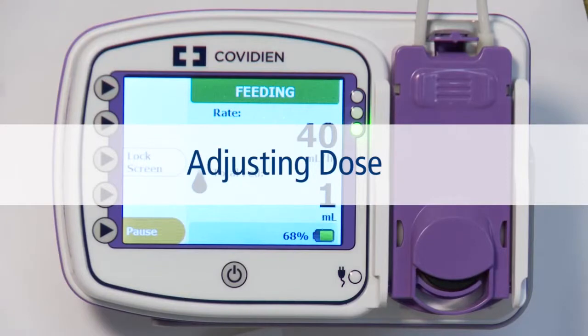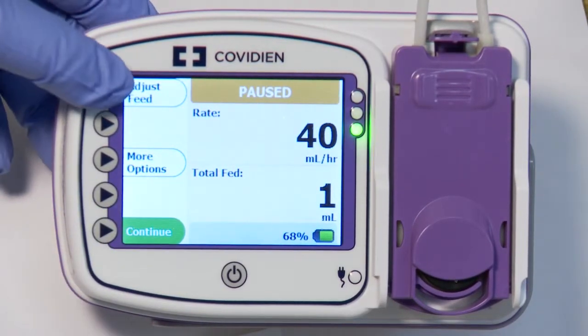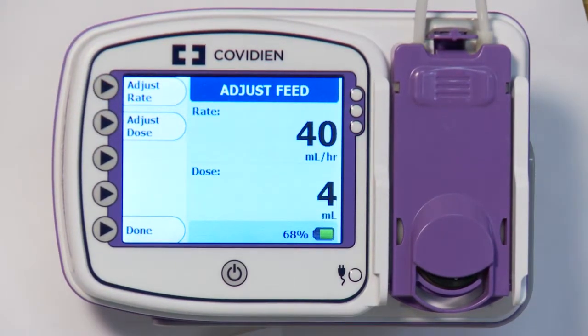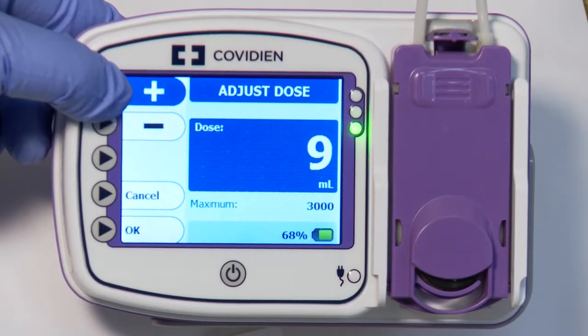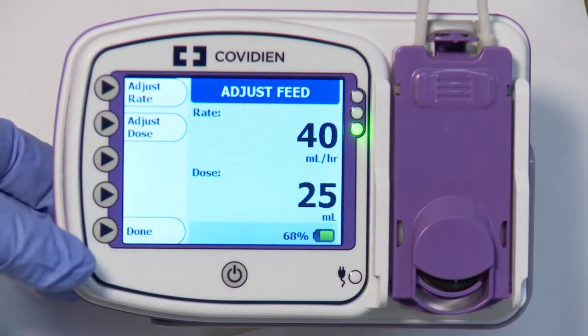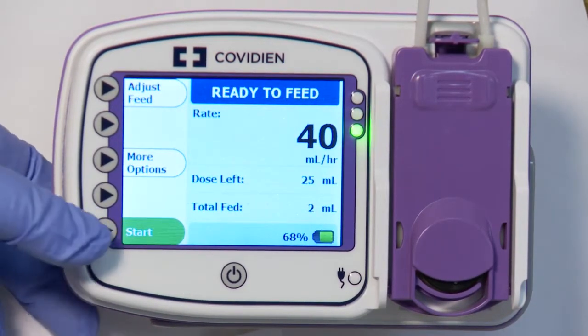From the feeding screen, pause operation if the pump is feeding. Select the Adjust Feed button. If the dose feature has been enabled, the Adjust Dose button will appear below the Adjust Rate button. Press the Adjust Dose button to set the maximum amount of feeding solution to be delivered. Select OK, then Done to return to the feeding screen. Select Start to begin feeding.